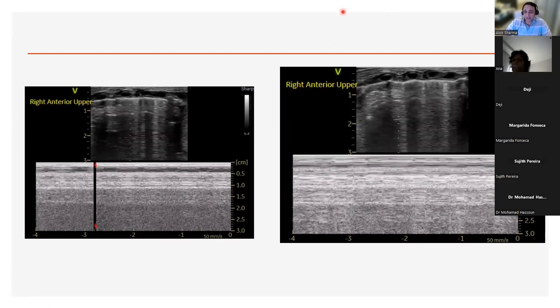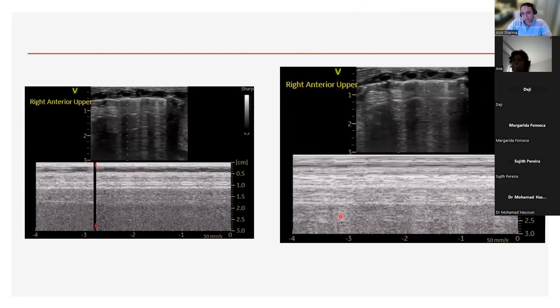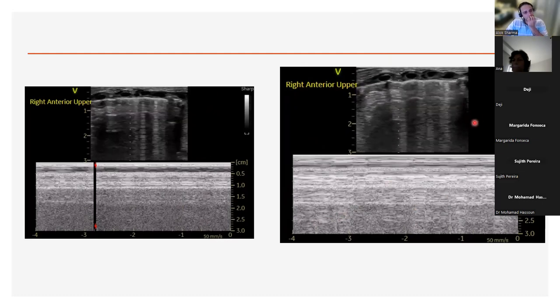But if time permits, an ultrasound is available on the unit. I can do it in literally a few minutes, boot the scanner up. This scan took me 2 minutes to finish while I'm waiting for somebody to run across, my radiographer to come in and get the chest x-ray machine from the chest x-ray room. It'll take me 30 minutes in Southampton to get an x-ray.